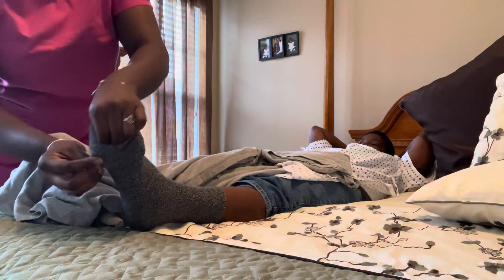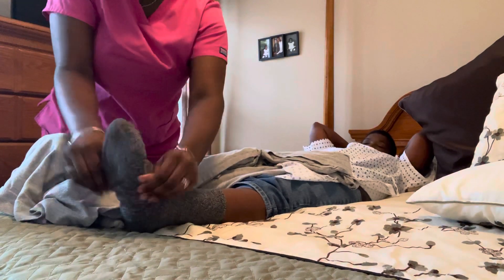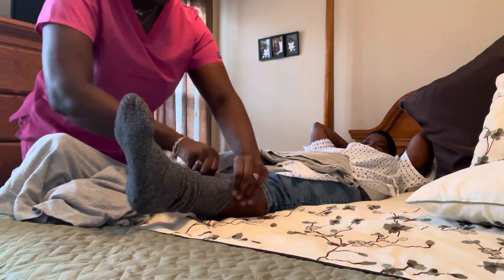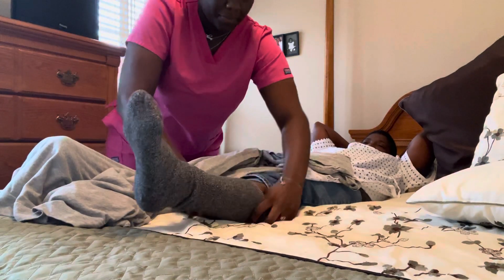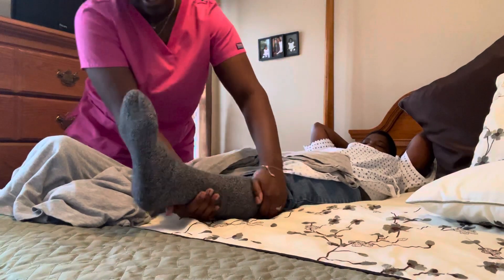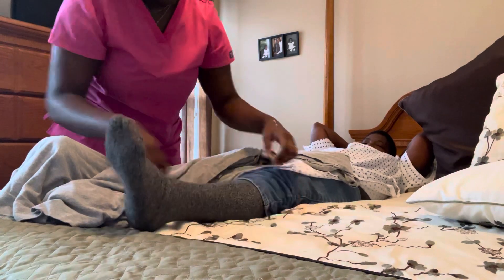Making sure that the opening at the top is over the patient's toes. Adjust it so that there are no wrinkles or creases, making sure not to overstretch the stocking, and pulling it towards the patient's knee.